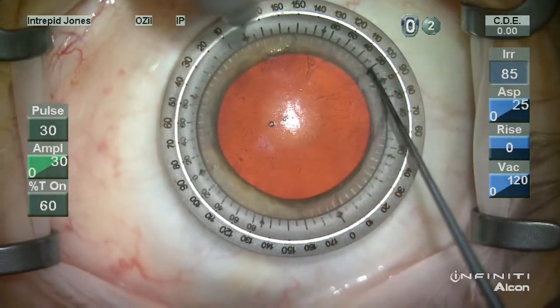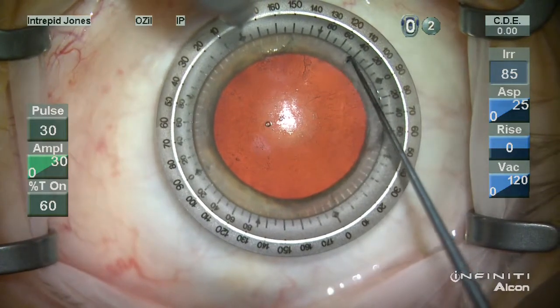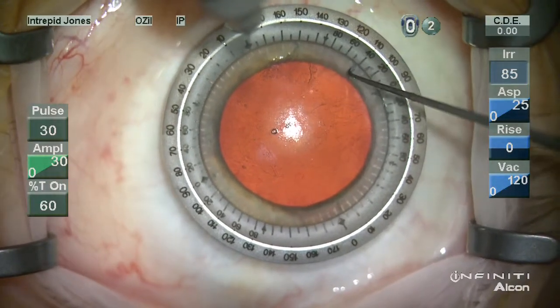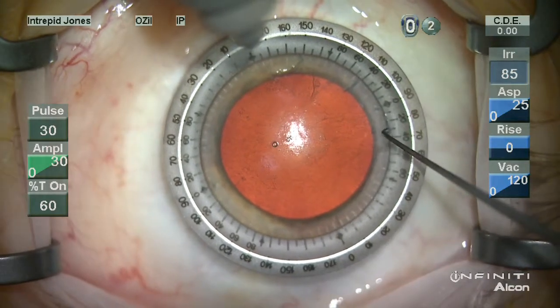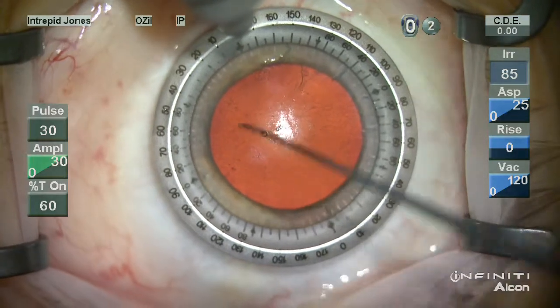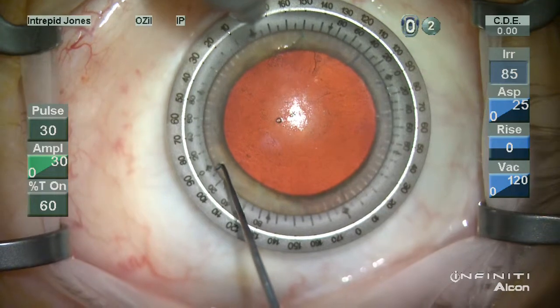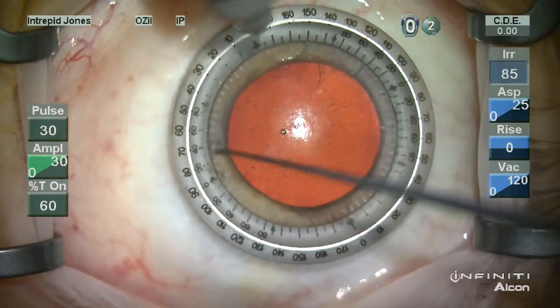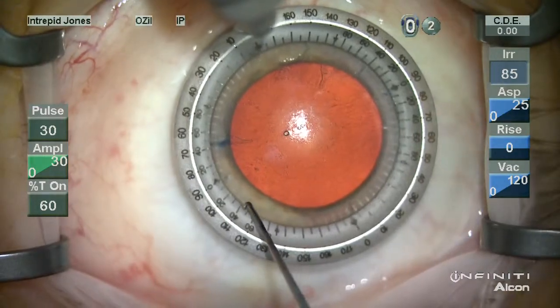The ring is then rotated, and the marks are then placed for a 45 degree arc, measuring out on each side of the reference mark made just in the previous step. You can see that the inner bevel here has an easy readout to arcuate length on either side of the 0 degree mark, although I do like to step out these values to ensure that I have a proper arcuate length.